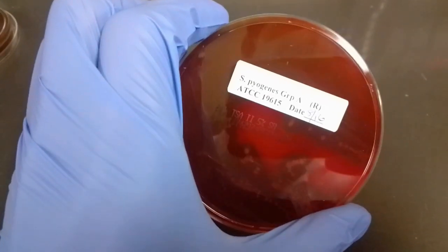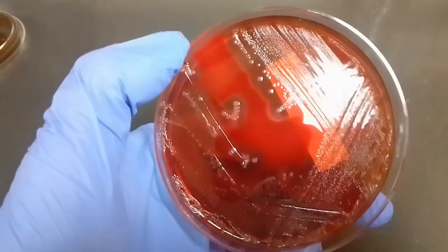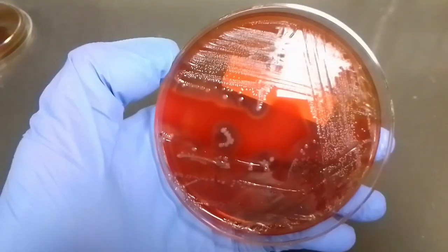So this is checking for the presence of Group A Streptococcus, or Group A Strep. Specifically, this is Streptococcus pyogenes. So this test is a PCR-based test, and it's going to correlate with the presence of having strep throat.